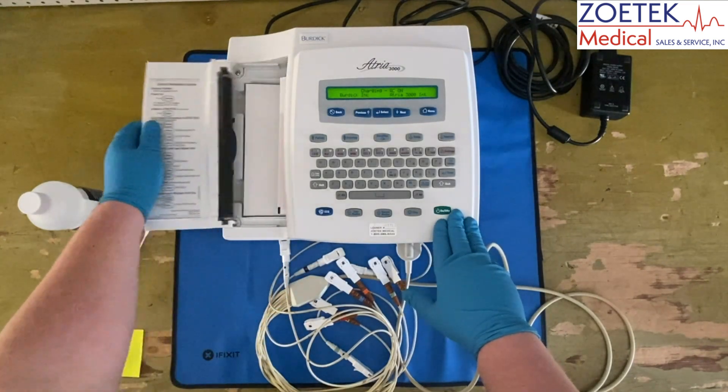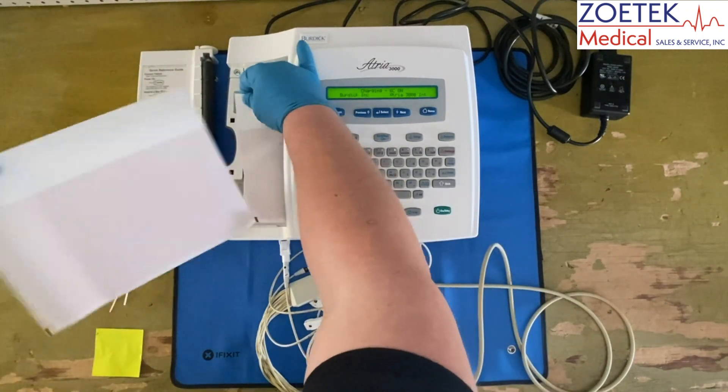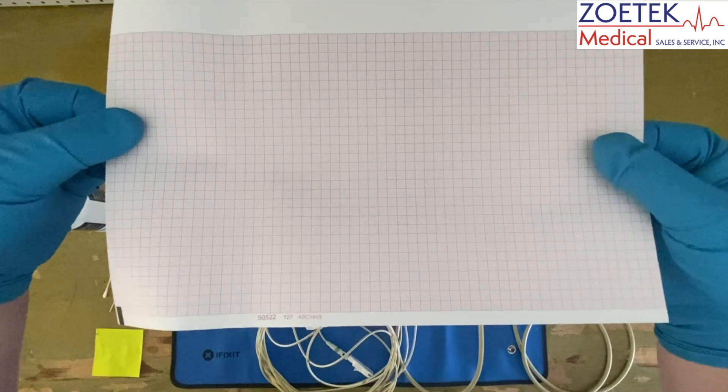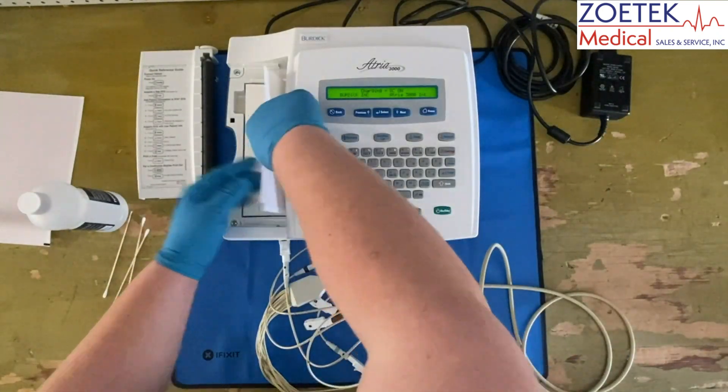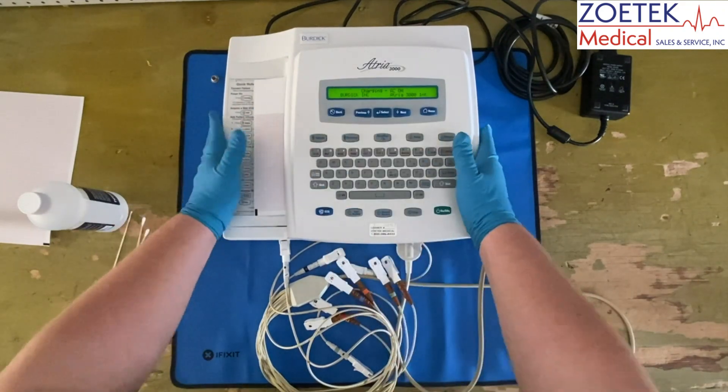Open up the printer door and check to see if the paper has been installed correctly. Confirm the printer paper installed is the correct model for the EKG. Non-manufacturer approved paper will cause errors, such as misprinting or not printing at all.